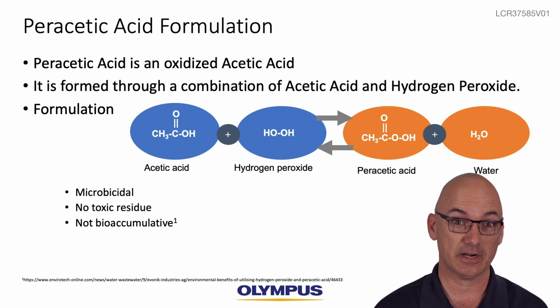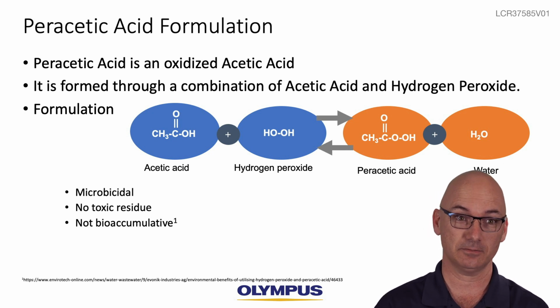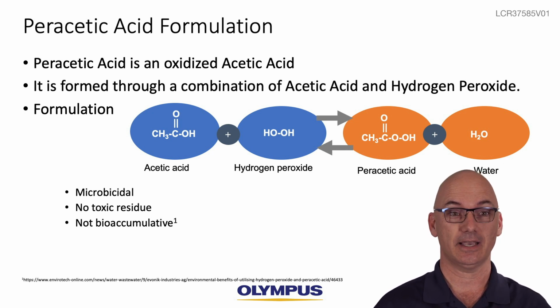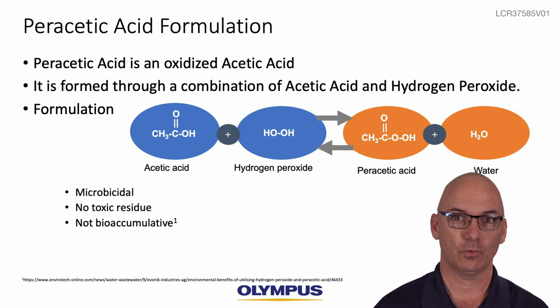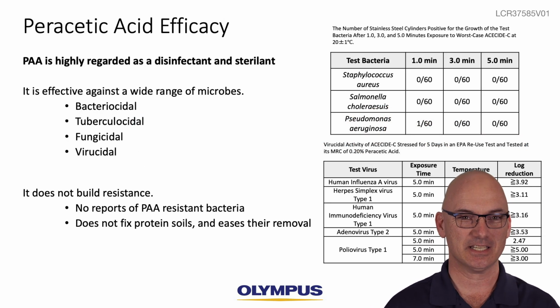And key to that is peracetic acid as a liquid chemical germicide. It's microbicidal, it has no toxic residue, and it's not bioaccumulative when used as a disinfectant. So I mentioned that peracetic acid is highly microbicidal, which is very important when reprocessing a medical device.